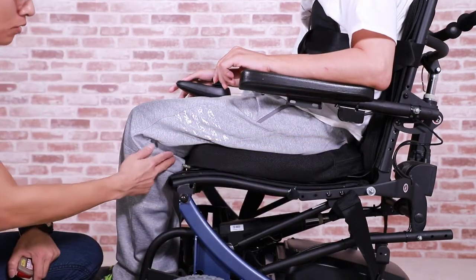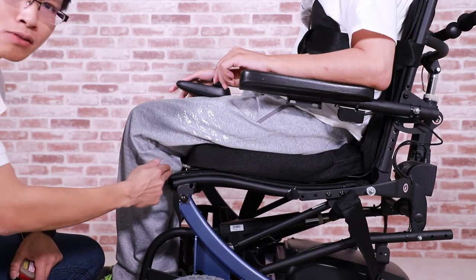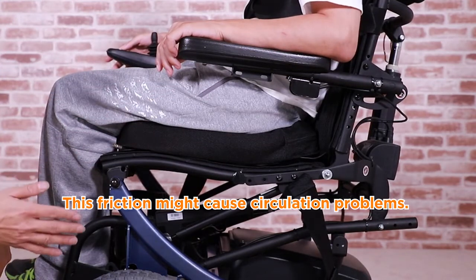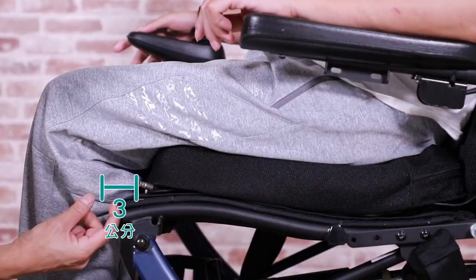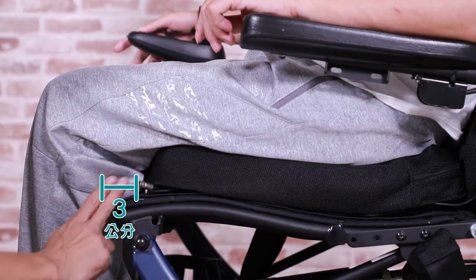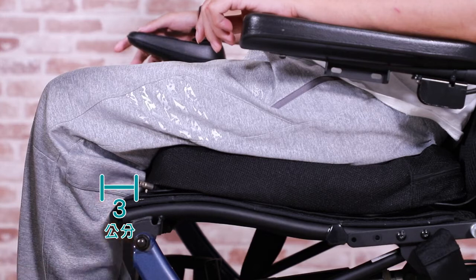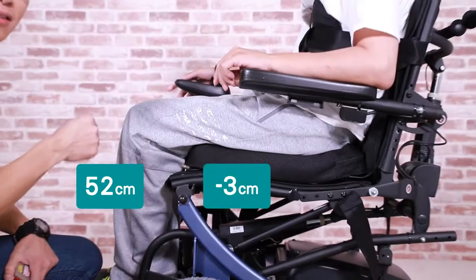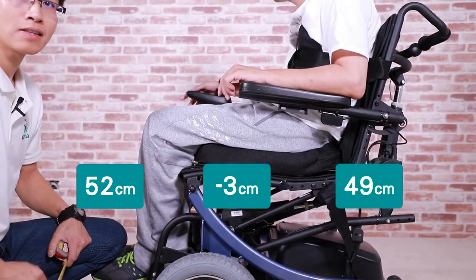Generally, we want to avoid the friction between the back of the knee and the seat cushion. This friction might cause circulation problems. Therefore, we reduce 3 centimeters from what we've measured. 3 centimeters is actually about 2 fingers wide. Now, Mr. Zhang's thigh length is 52 centimeters. Minus the 3 centimeters gives us 49 centimeters.